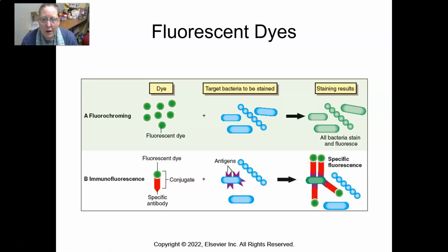And so there are two ways this can work with the microscopes. You can put a fluorescent dye on the specimen, and it will bind to the target bacteria or yeast or whatever, and it will all glow regardless of the morphotype. So it's just if it's there, and you can visualize it in a tissue specimen or whatever.